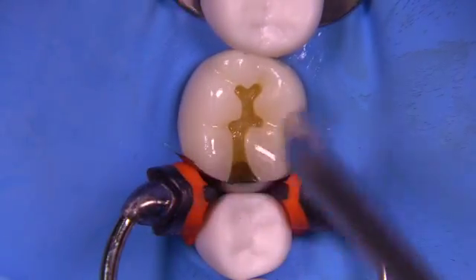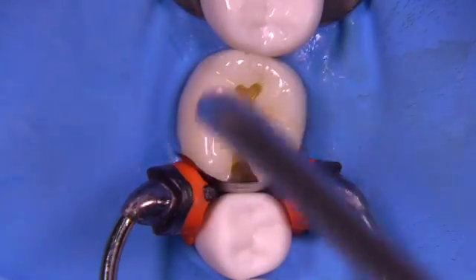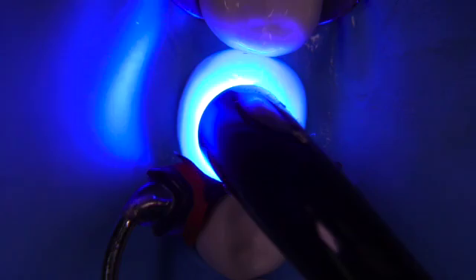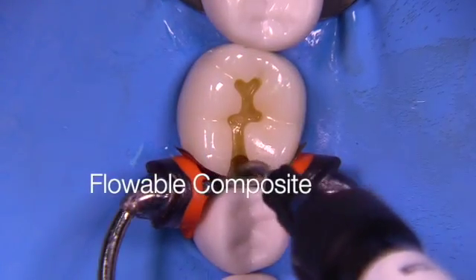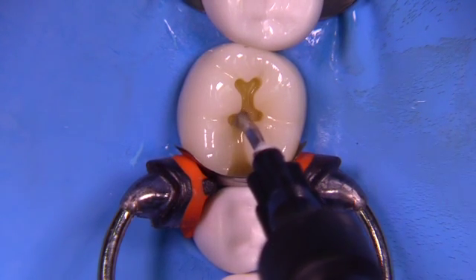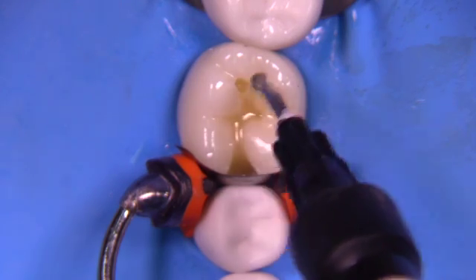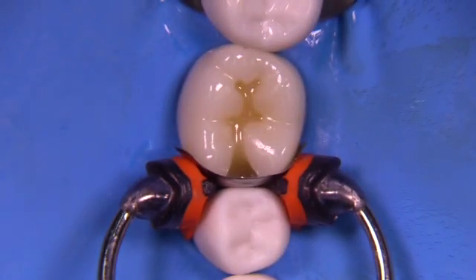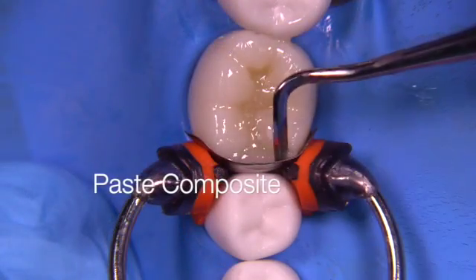We're now using a little bit of universal adhesive to get the surfaces wetted, and then we're going to light cure for the appropriate amount of time for the material. I'm going to use an injection molded technique — thank you Dr. David Clark — and I'm going to use this technique to facilitate the adaptation of the paste composite which will be inserted after the flowable.